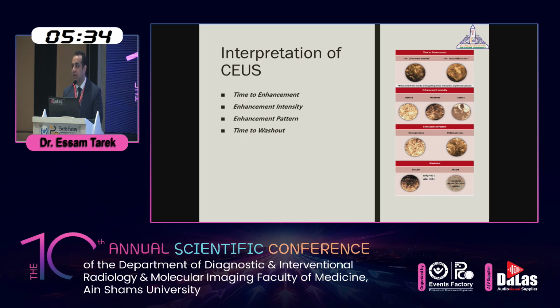And finally, the time of washout. This is the time elapsed from contrast agent administration until the contrast starts to wash out. Early washout is defined as within 60 seconds. So again, we have two very important numbers, 6 seconds and 60 seconds.